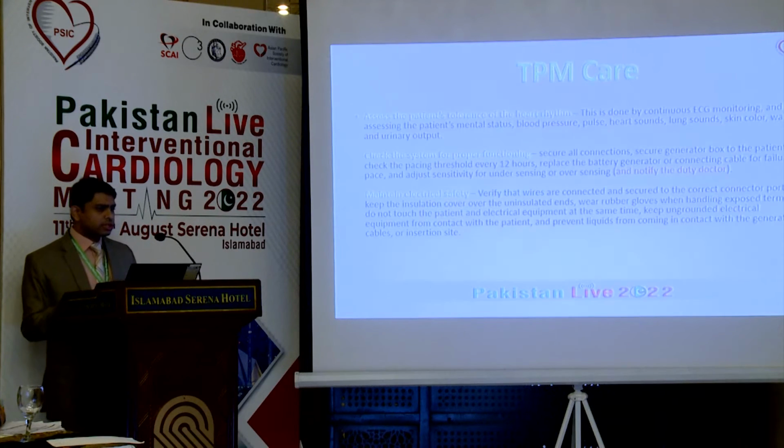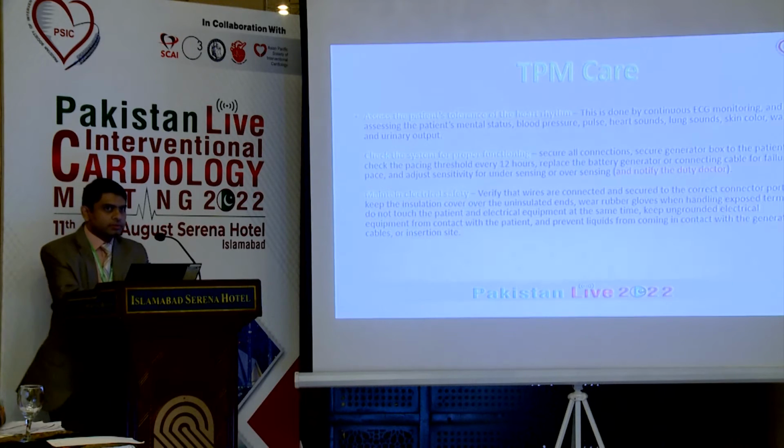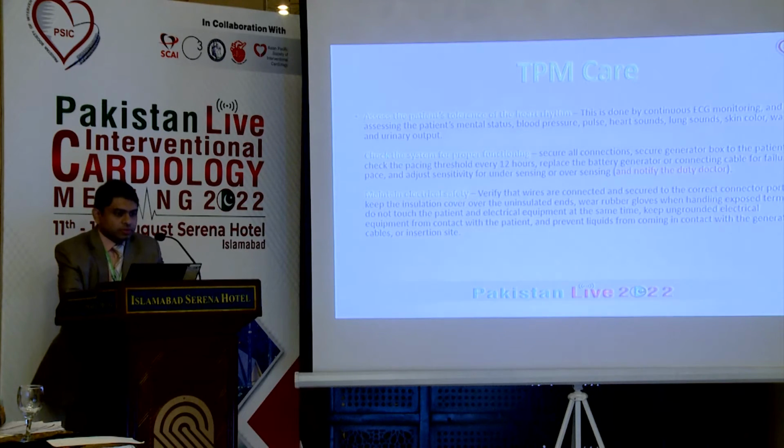After that, the most important thing is the TPM care of the patient. You should be assessing the patient's heart rhythm.